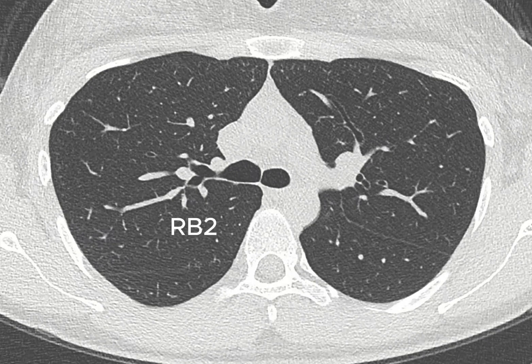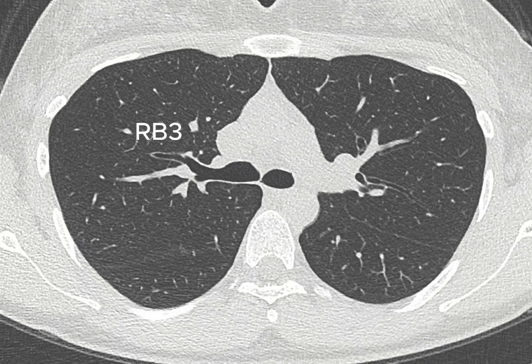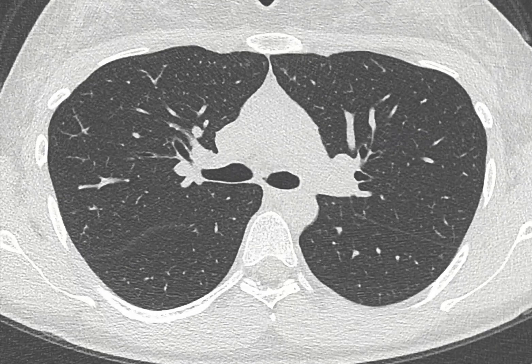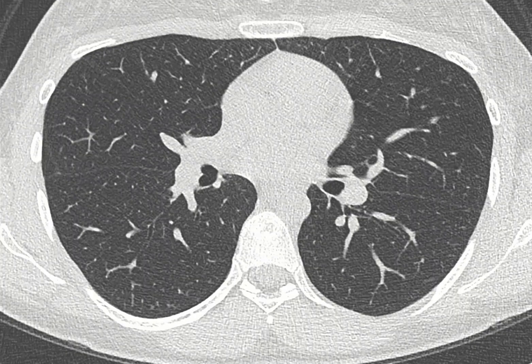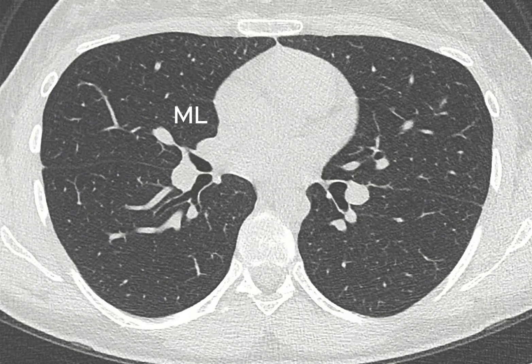Next is the RB2, the dorsal branch of the right upper lobe. It has a more longitudinal appearance because of its dorsal direction. Then the RB3, which has a quite similar appearance to the RB2 but in the ventral direction. As we travel down the intermediate bronchus, we reach the ostium of the middle lobe bronchus. And opposite the middle lobe bronchus, as you know from bronchoscopy, we can see the RB6, the apical segment of the lower lobe.